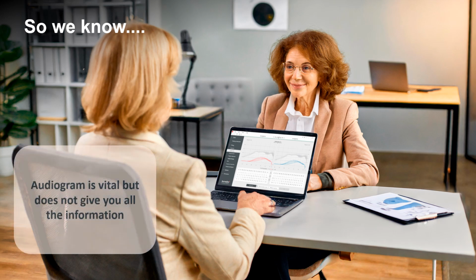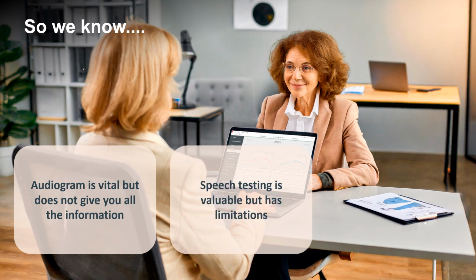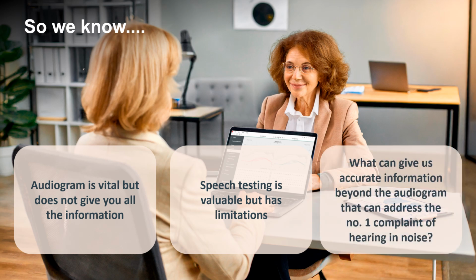So, we know the audiogram is vital to program the hearing aid, but it's incomplete and does not give you all the information. We know that speech testing is a great addition, but it has many limitations. So what can give us accurate diagnostic information beyond the audiogram that can address the number one complaint, which is hearing in noise?